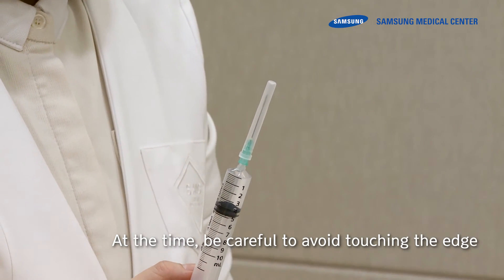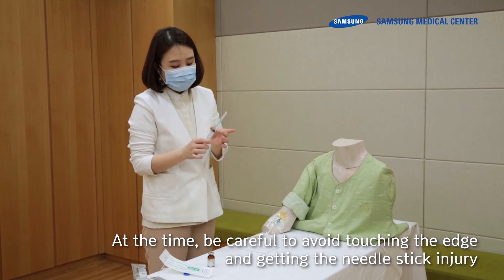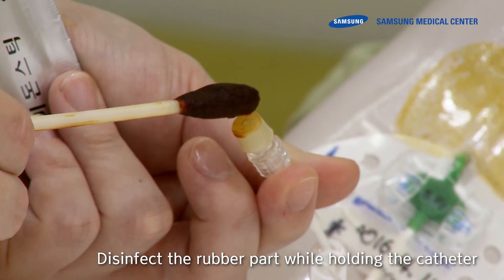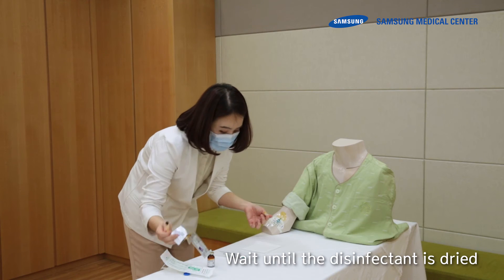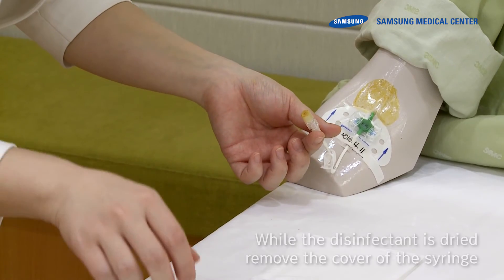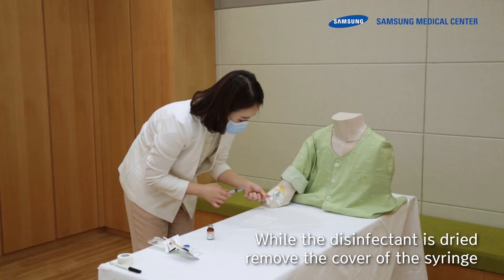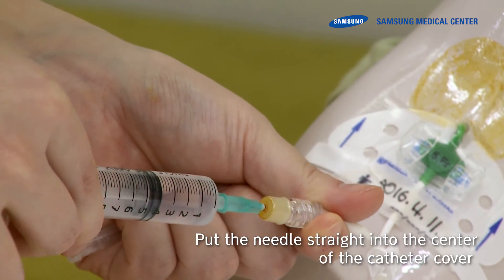Be careful to avoid touching the needle edge and getting a needle stick injury. Disinfect the rubber part while holding the catheter. Wait until the disinfectant is dried. While waiting, remove the cover of the syringe. Put the needle straight into the center of the catheter cover.